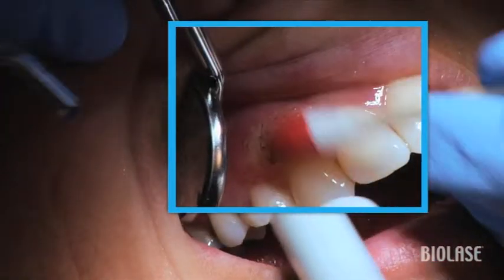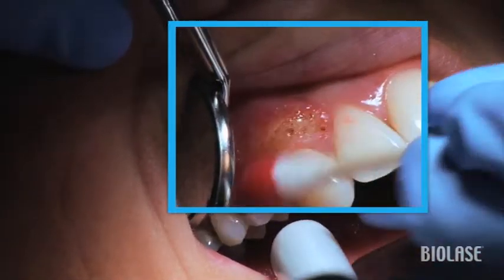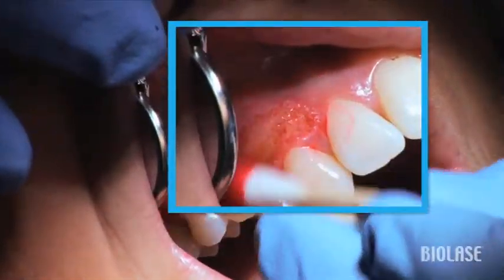If some of the tissue sticks to the excision site, take a cotton swab with some topical anesthetic on it and burnish the site. The iLase removes excess tissue in a very precise and controlled manner.